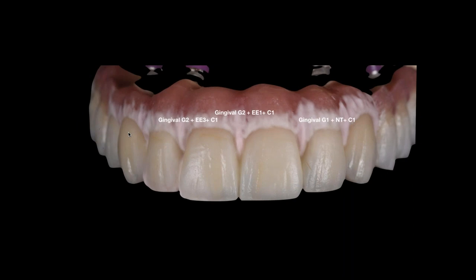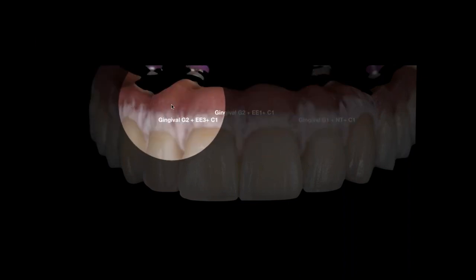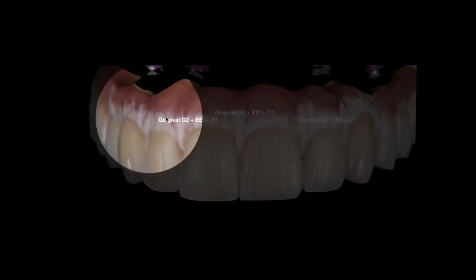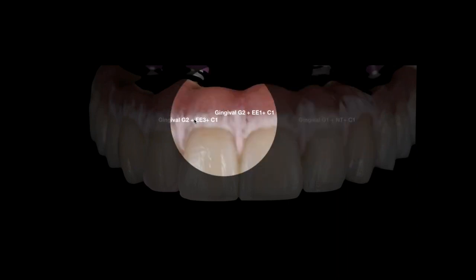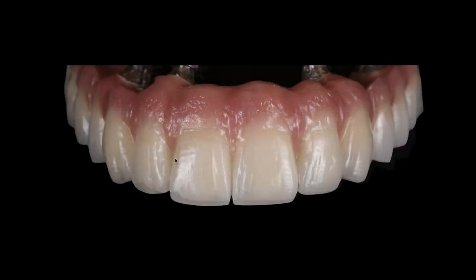And I think I told you in the last webinar that I handle most of the pink part of this really towards the end. So you can see that I've got all my pink fired in my first and second bake, but realistically, I'm doing all my final pink right here in the final glaze bake. And that's where I like to get that final detail and contour out of the pink.